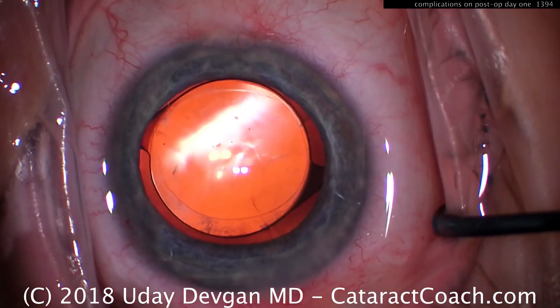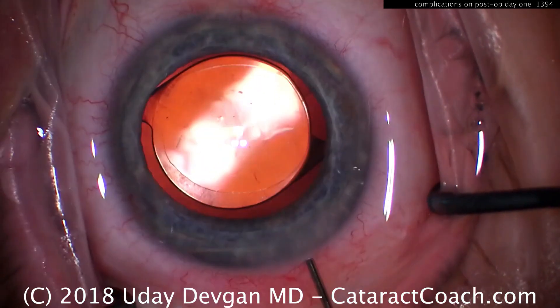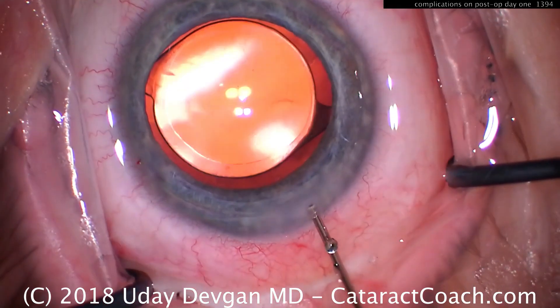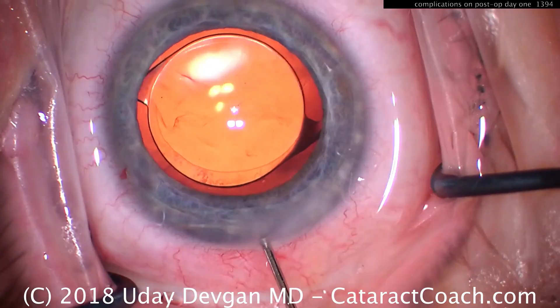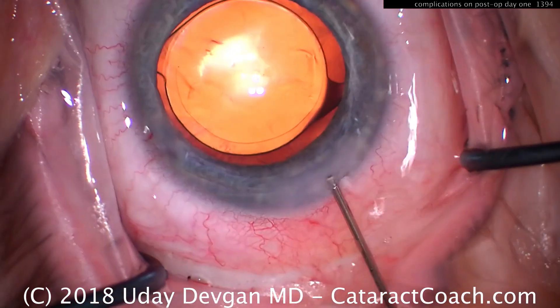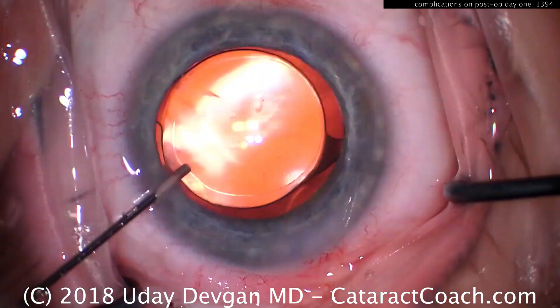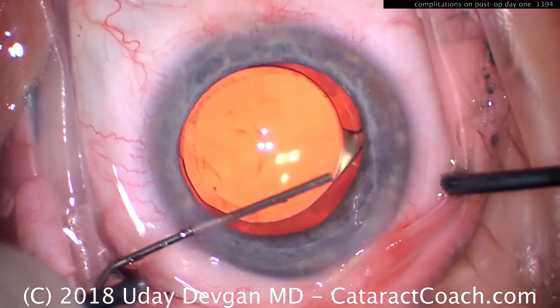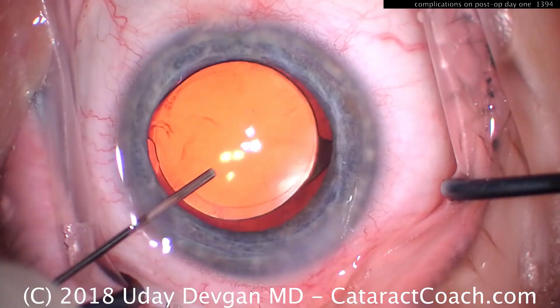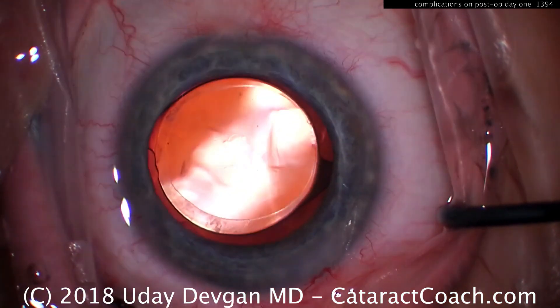It looks like we've removed all the viscoelastic. The rhexis overlaps the optic — looks like a pretty good case. Let's seal this up and go on to the next surgery. We'll seal the incision; all looks pretty good. You don't notice anything unusual. But this patient is going to have a pressure of 50 millimeters of mercury on post-op day one if you don't do the angle sweep.